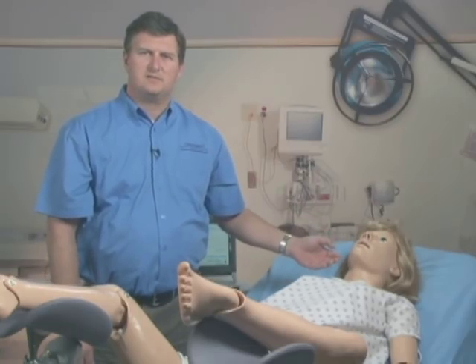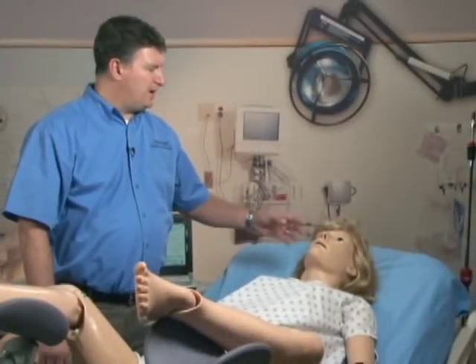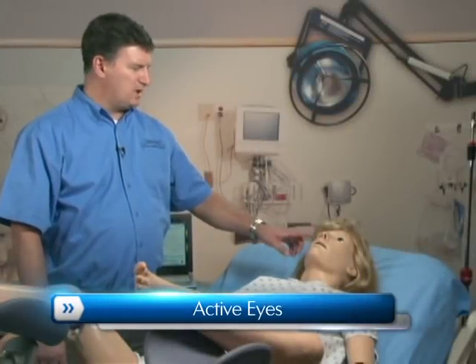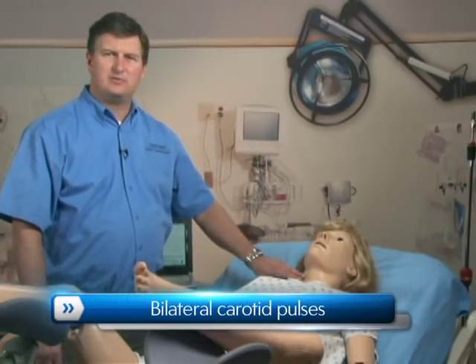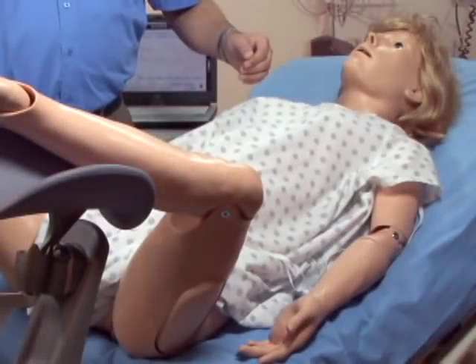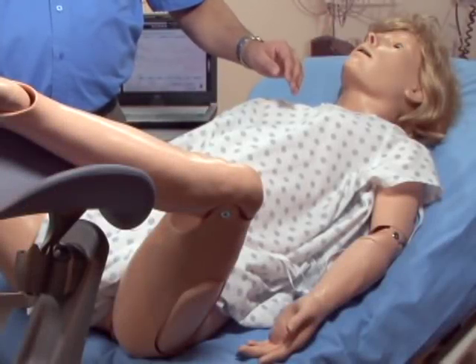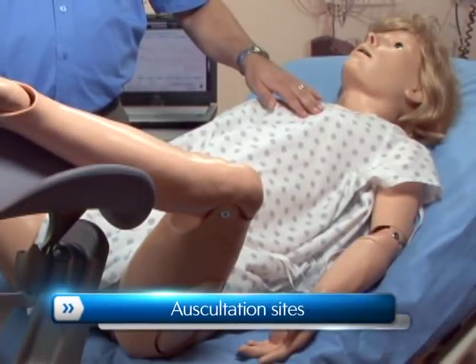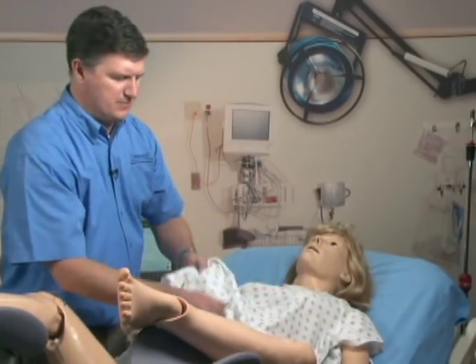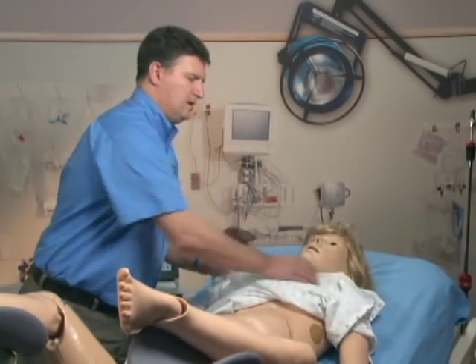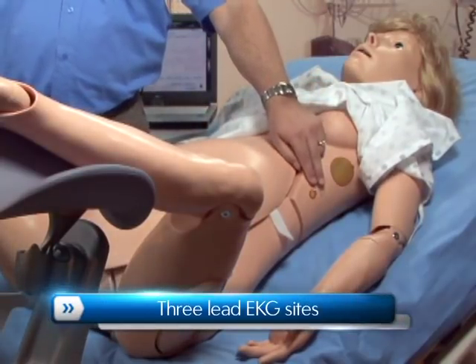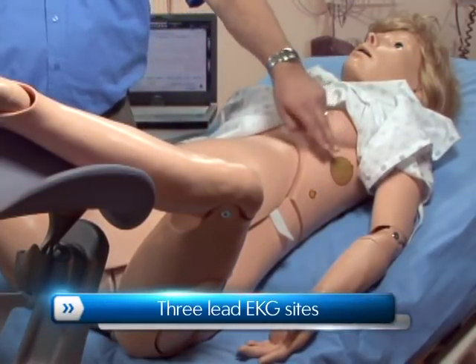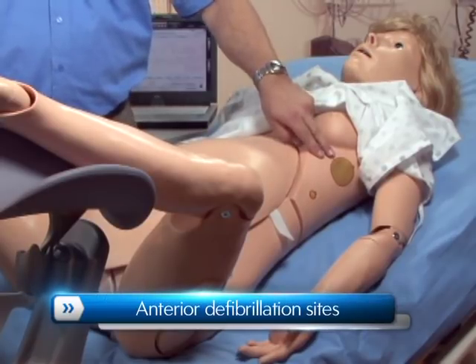To begin with, I will review the basic features of the simulator. NOEL has the active eyes, both oral and nasal intubation, and bilateral carotid pulses. Moving on down, NOEL has auscultation sites for the heart and lung sounds. There are also sites for external 3-lead EKG and anterior defibrillation sites.